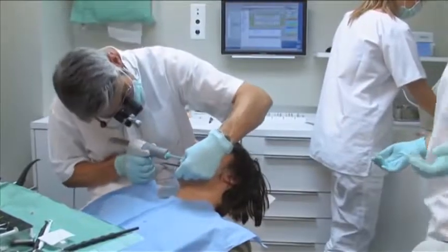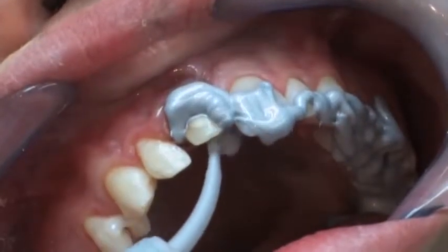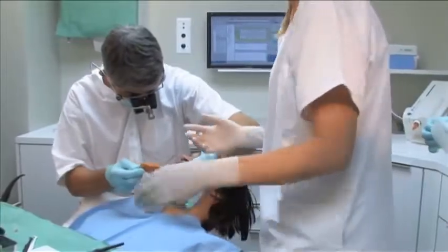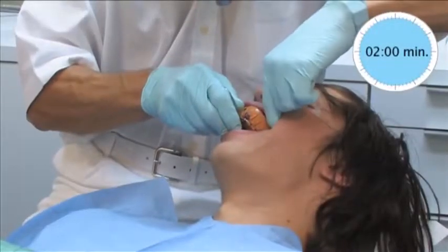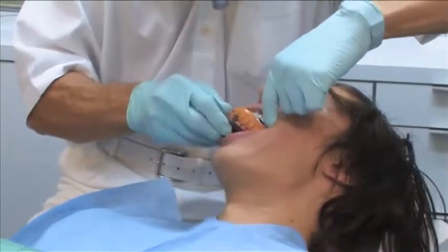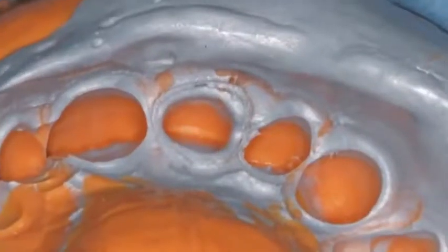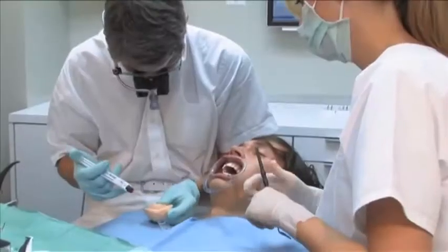Using the convenient microsystem dispenser, the wash material is easily applied directly into the mouth. Filling of the tray and syringing the wash material should be completed simultaneously. The one-step putty wash impression is performed using a Finis heavy body and a Finis Precious light body. This precision impression material distinguishes itself by its easy readability of detail thanks to its silver pigmentation.